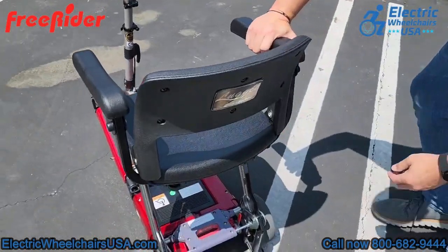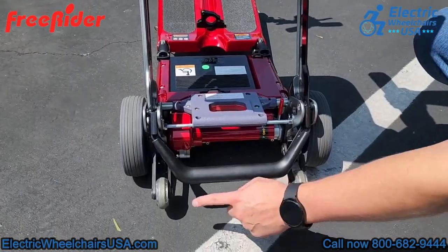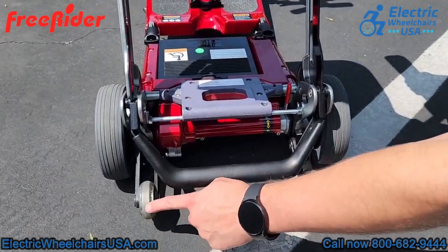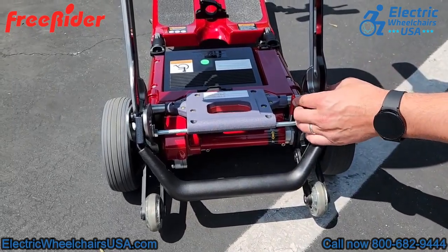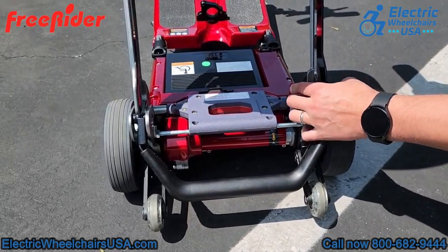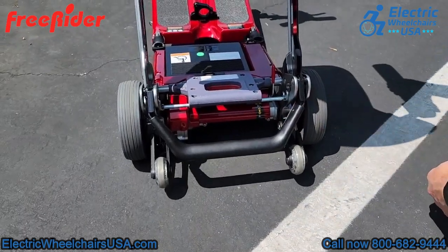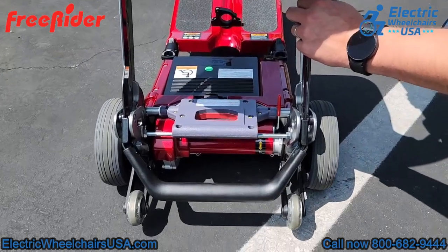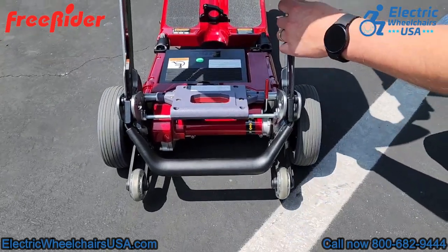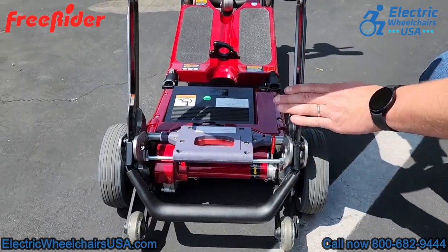At the back of the scooter, these are rear anti-tip wheels. These are on the scooter for added safety — if you're going up a steep incline, it just prevents you from tipping backwards. Like all powered mobility devices, this red lever is your freewheel lever. If you press it forward, that will put the scooter into neutral and you can push the scooter. Just keep in mind that you cannot operate the scooter in freewheel mode; you have to press the lever back into the drive position to operate it.